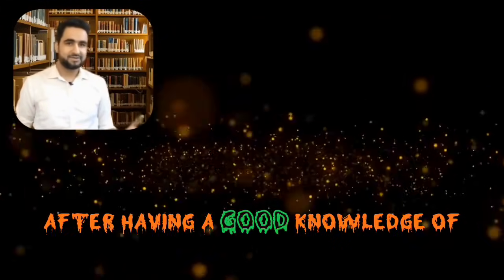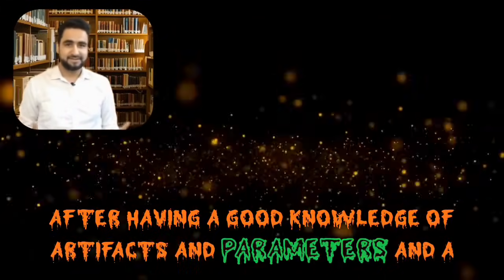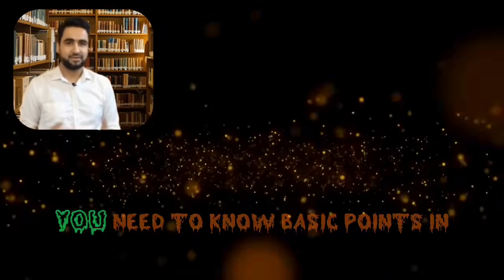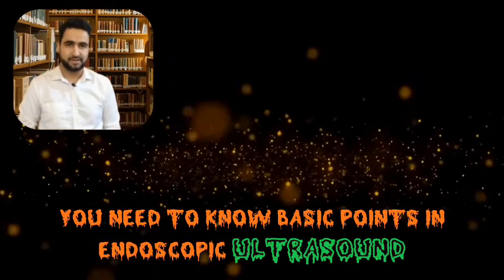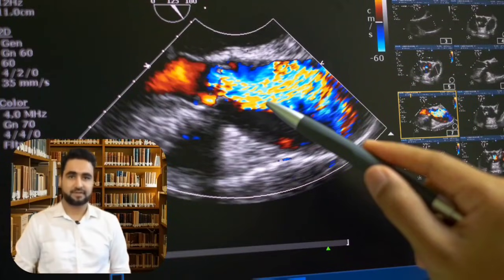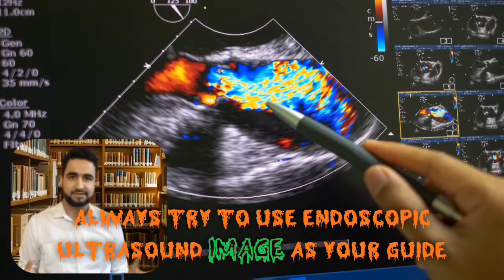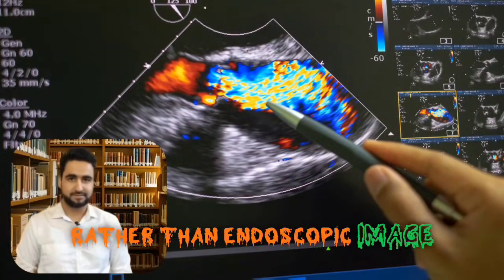After having a good knowledge of artifacts and parameters, and a guarded control on scope handling, you need to know the basic points in endoscopic ultrasound. The first point: always try to use the endoscopic ultrasound image as your guide rather than the endoscopic image.